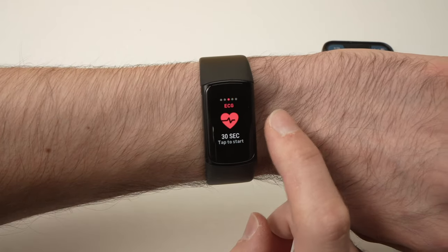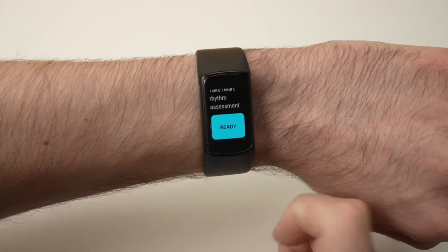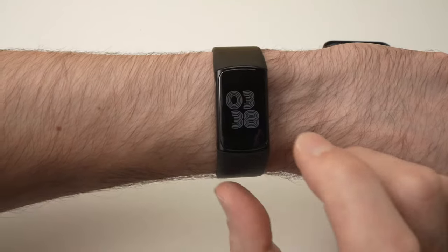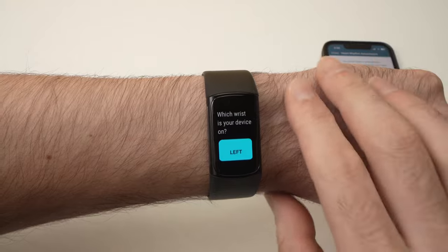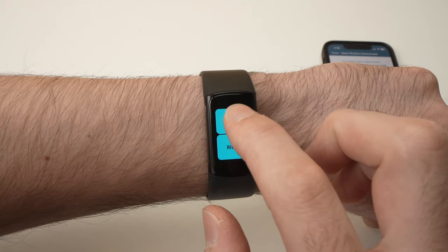Back on the Fitbit, go to ECG and tap on it. Go down and now you should see Ready, since we've set up the function on our phone. Press the Ready button. It will ask which wrist you're wearing your watch on — in my case it's left, so I'll press Left.